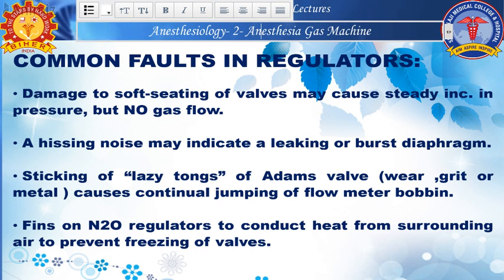The fins on the nitrous oxide regulators conduct heat from the surrounding air to prevent freezing of the valves. Otherwise, with nitrous oxide, there would be ice formation that can result in freezing of the valves, or the valves can get stuck.